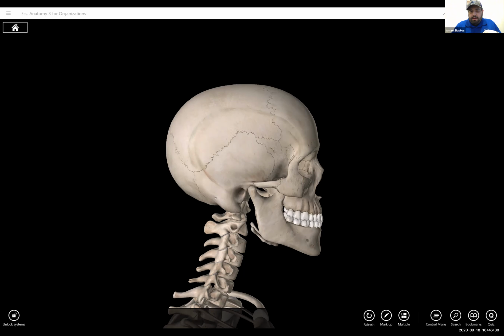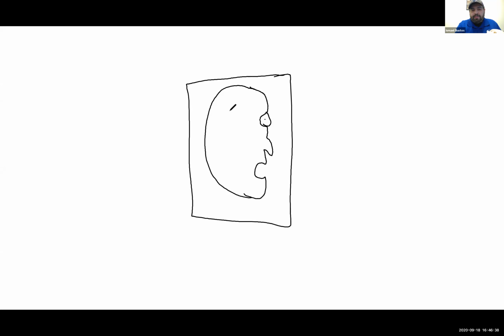And we want the OML, let me go back to my other drawing. Hopefully it's still there. Yep. We want the OML. We'll pretend the ear is here. All right, there's my ear. We want this OML to be perpendicular to the front edge of the image receptor.